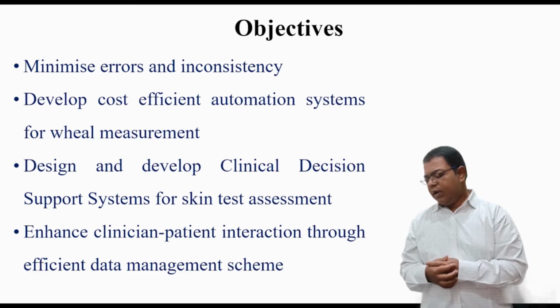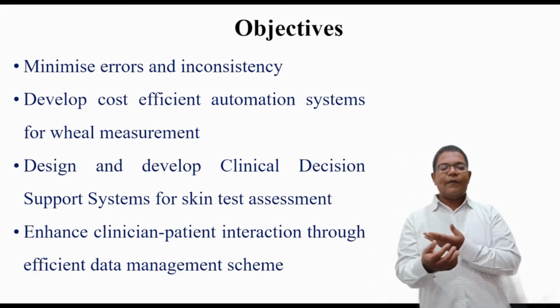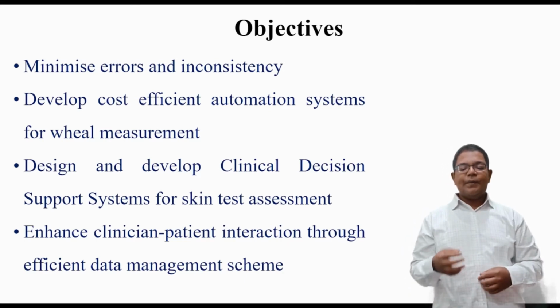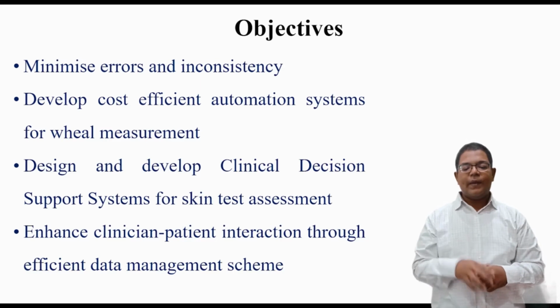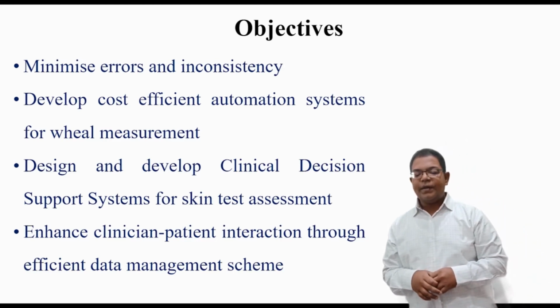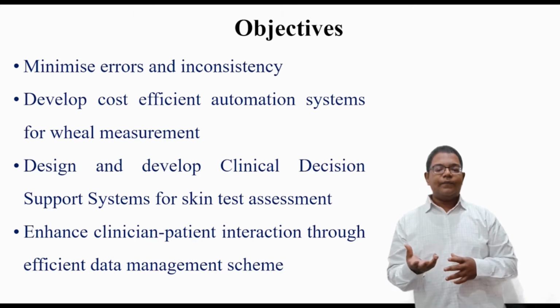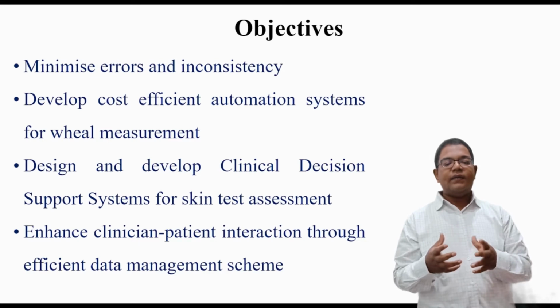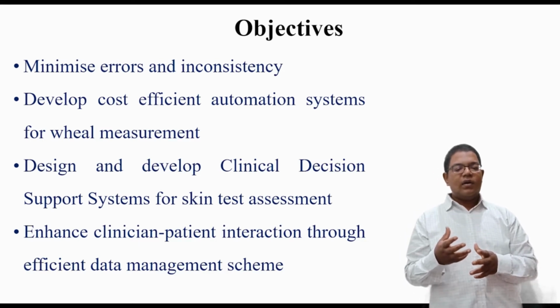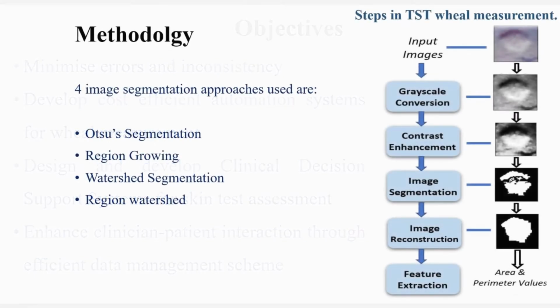To ensure this, the patient has to take a photograph of this image, and the input images are obtained in PNG format from the medical photographs shot using mobile phones. With the application of histogram equalization and grayscale conversion, the images are enhanced, and a contrast is generated between the foreground and the background.